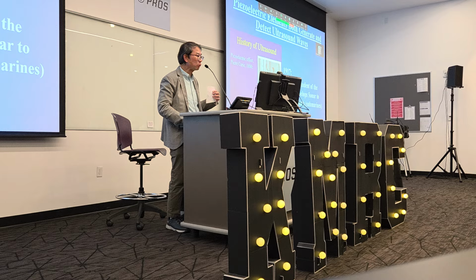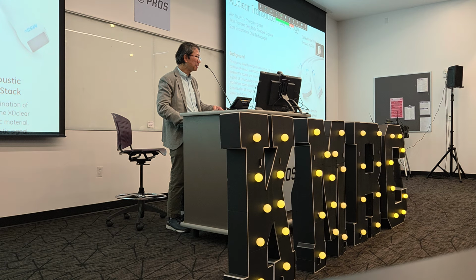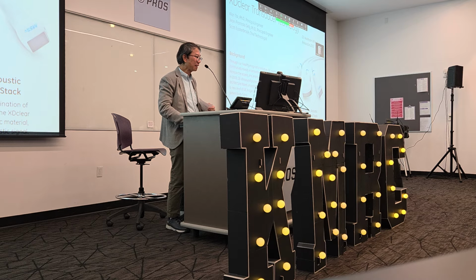So the piezoelectric effect in ultrasound is almost 100 years old, and I worked at General Electric before I joined GCU as adjunct faculty. I worked with a team to come up with a new single crystal, and this is some of the paper I presented, to improve the penetration of the ultrasound so you can see the organs inside the body better.